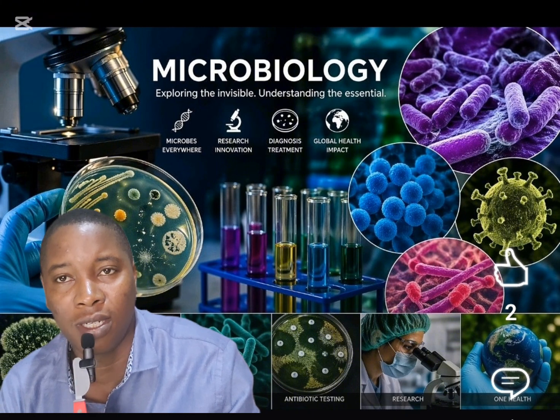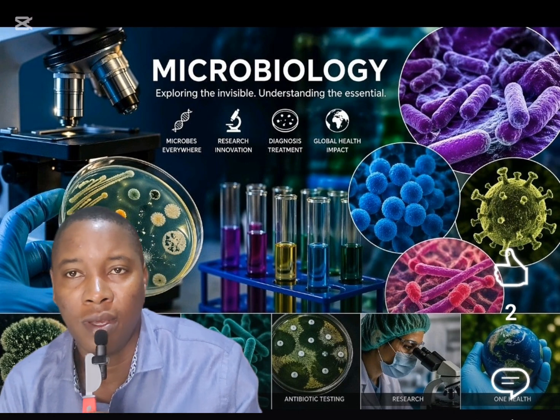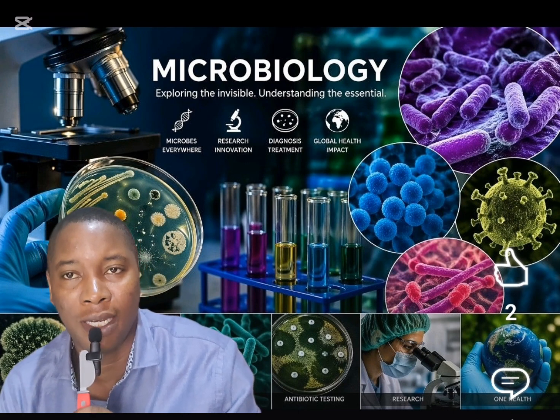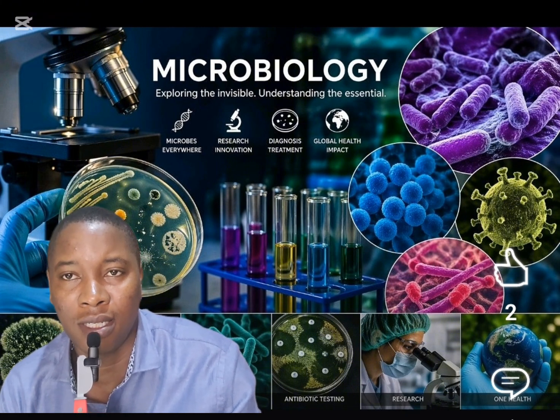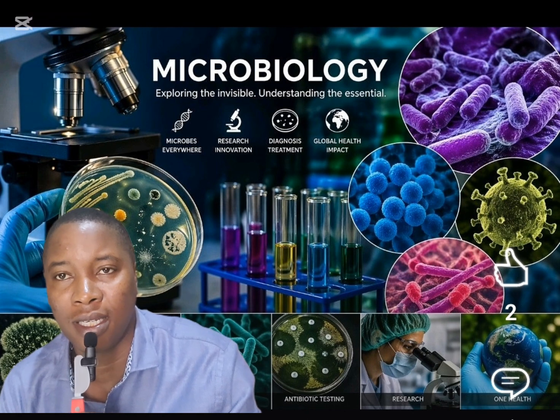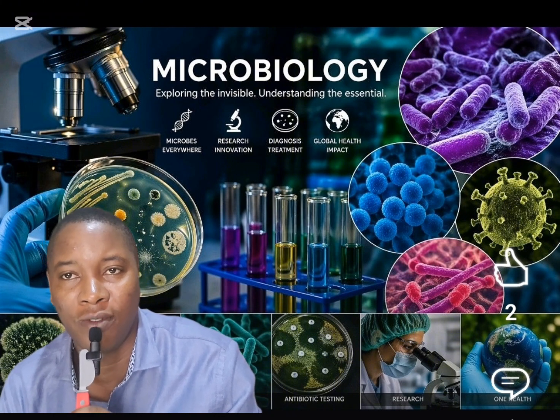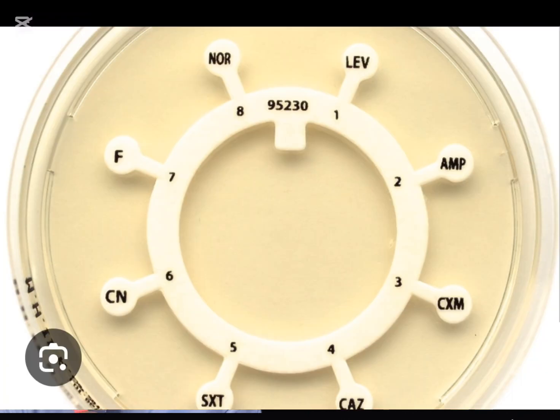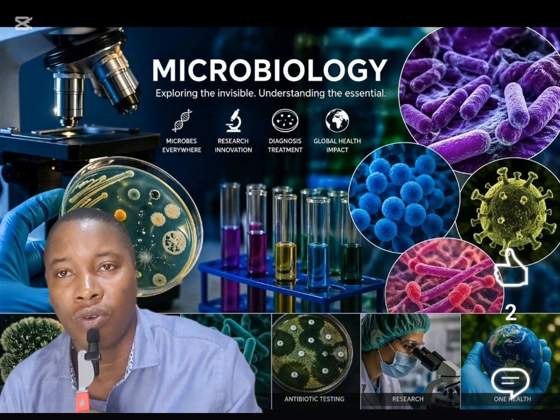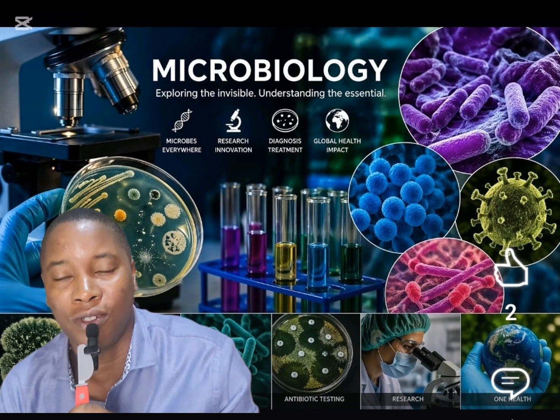Now, interestingly, this method is not new. It's been around since the 1960s, and there are many ways of doing it. But one of the most common ways is the Kirby-Bauer method, which is also called the disc diffusion method. It's a method where you have a paper disc that has been impregnated with different types of antibiotics at different concentrations, different dosages. You inoculate your bacteria, or different bacteria that you want to test, onto Mueller-Hinton agar, and then fix your disc and allow for 24 hours, and then come to read.